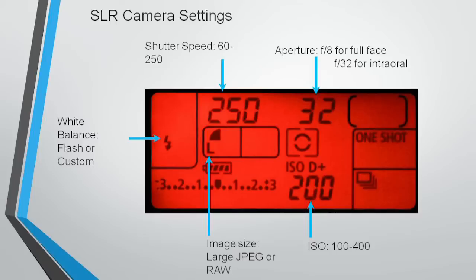And we're going to talk about all of this. The aperture, everybody knows f-stop. Correct. So we're going to talk about what is f-stop. Many people heard it, but nobody knows what it is. We're going to talk about ISO, right? ISO, correct. And what does it mean? And a really important point is also the white balance.